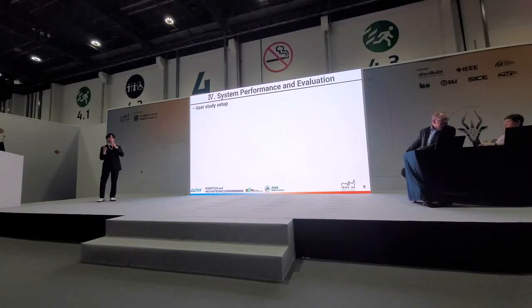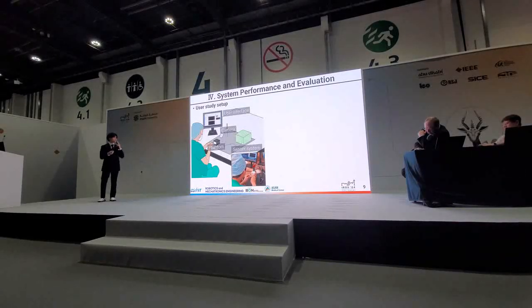Now, I will introduce the user study to evaluate the system's performance. The user study was carried out over 4 days with an anesthesiologist at Seoul Medical Center. The aim of this experiment is to detect the puncture of the ligamentum flavum and position the needle at the epidural space.